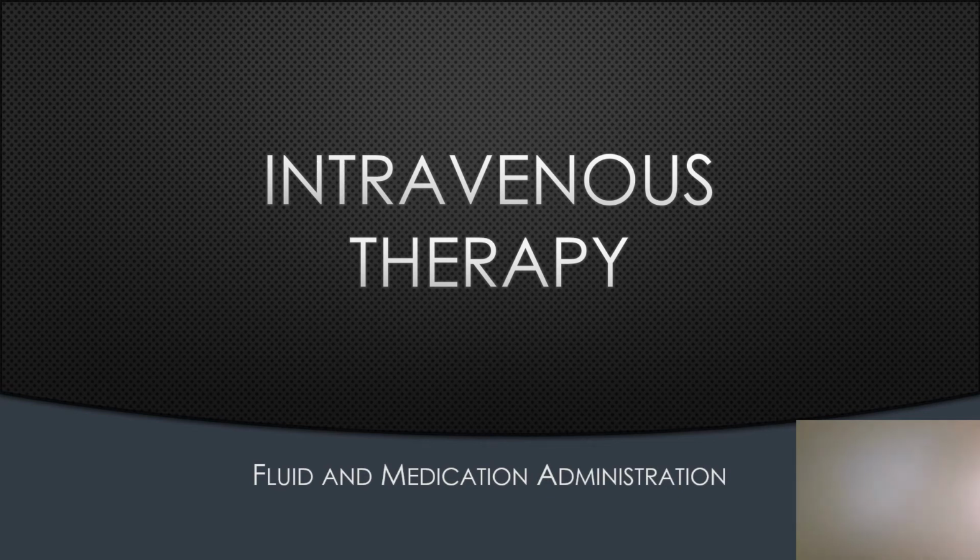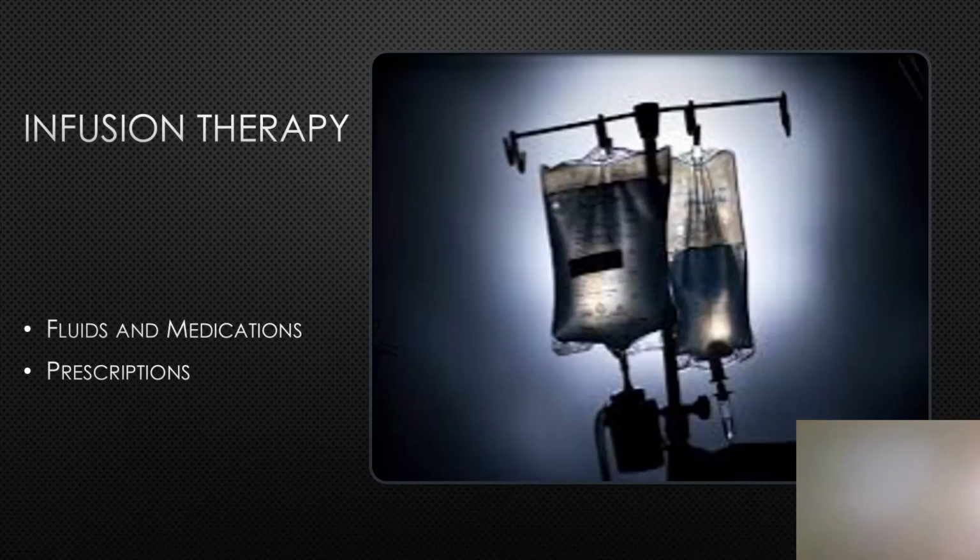Intravenous therapy, fluid and medication administration. Intravenous access provides direct access to the circulatory system, and this allows for a rapid drug action. We can also achieve precise dosage calculation and flow rates.